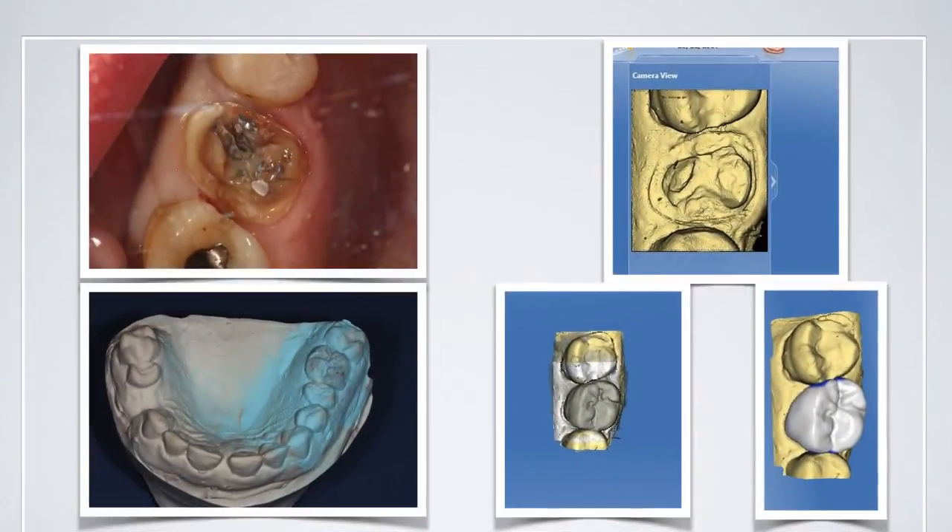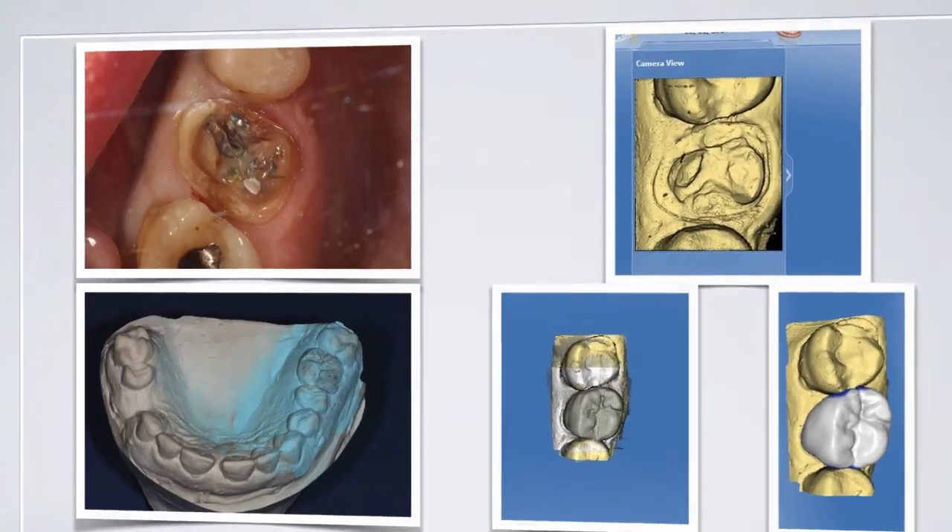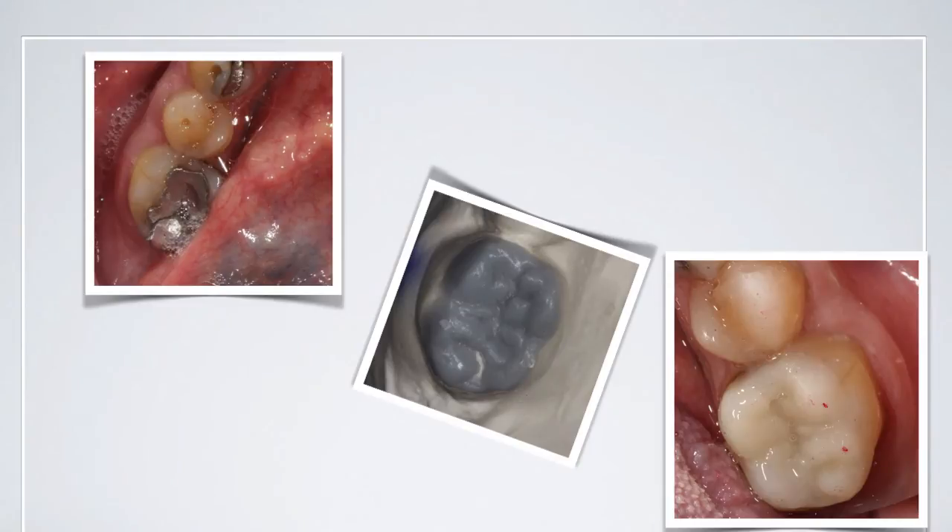A slight diversion: you can also use these wax-ups with the digital options available today — scan the wax-up, scan the preparation, and use that as a biocopy to create nice crowns that are direct copies of your wax-up. If you don't have Cerec or similar, you can see here what we did: we removed all the amalgam, placed a dentine core into the tooth, and then used that clear matrix to take the enamel layer home. Once cured in the way described, you actually end up with some pretty good anatomy, with occlusal marks exactly as predicted on the wax-up — so it really is rapid, precise, and very economic.